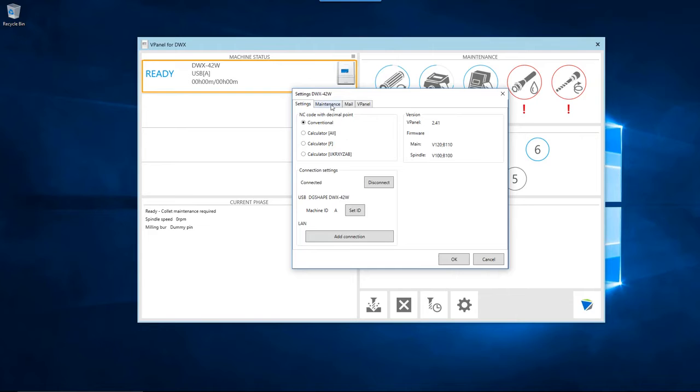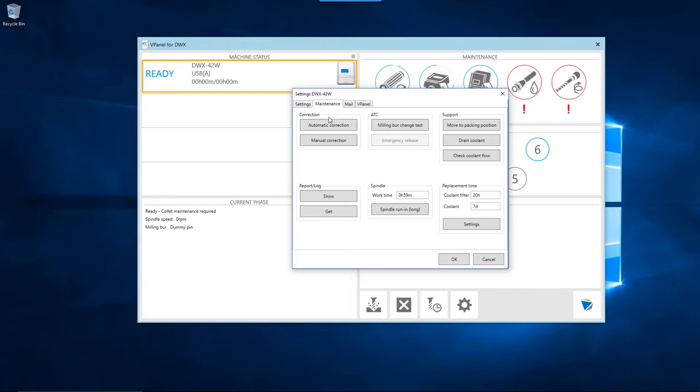Click on the Maintenance tab. Then, click on the Automatic Correction button in the Correction section of the Maintenance tab.